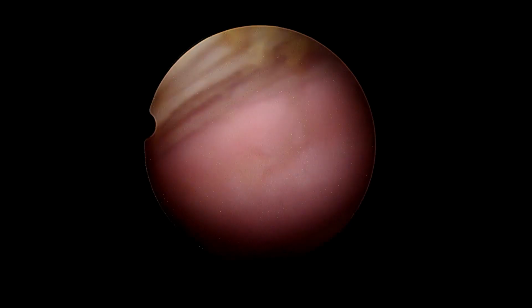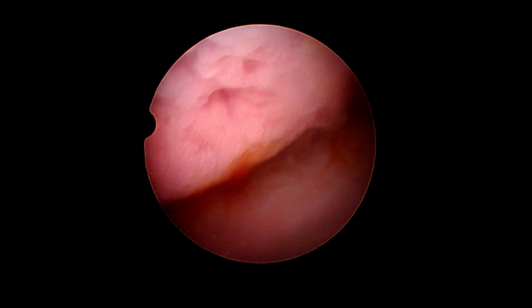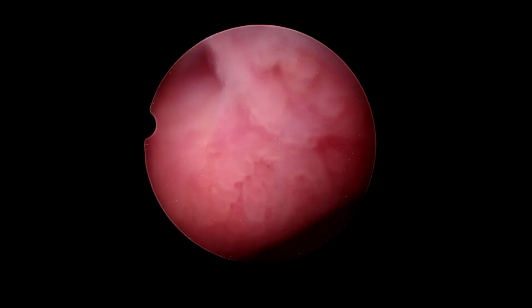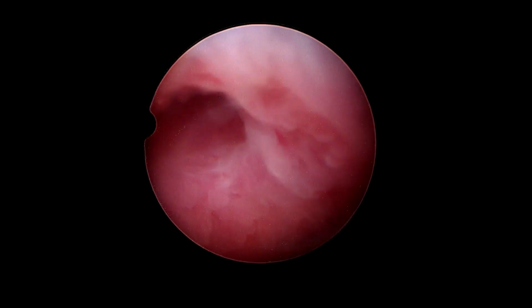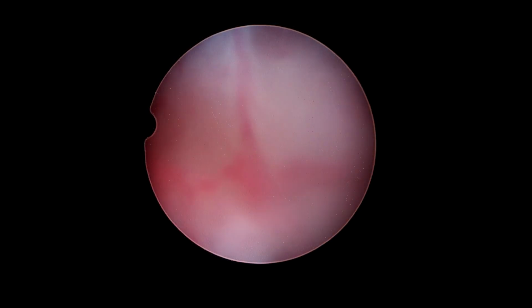This is the simple vaginoscopic approach that we use for all the patients of hysteroscopy. This is the cervix that can be visualized. The vagina appears absolutely fine, but if you notice the cervical opening, the external os is stenosed, and that was negotiated with the help of visual dilatation.